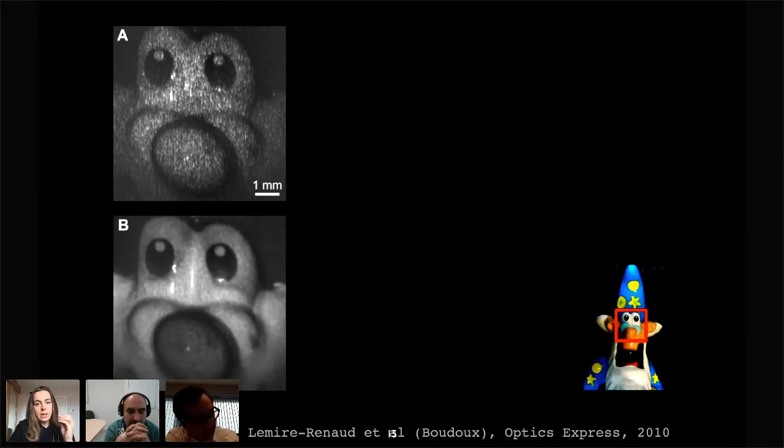By changing the fiber, you still get the same illumination from the core. So your laser goes losslessly to your sample, but you can scramble the image coming back and you get a much smoother image and a much more intense image. The signal to noise is 100 times greater. The photons in A are still available though. You collect these two channels, A and B, completely independently.